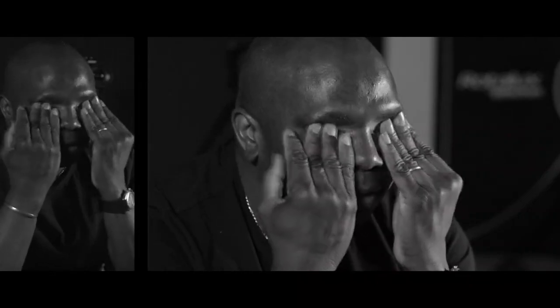This is called a mock-up smile, or a pop-in smile, or a test drive smile, whatever you want to call it. You're actually able to put it over your own teeth before you have the work done and visualize where you're going to go with it. It's based on a design that I create, just like an architect, and I can share it with my specialists, especially my laboratories, and we're all on the same page. That's how we get a really natural-looking smile that's in harmony with the face, because we use the face to create a smile that's just for that person.